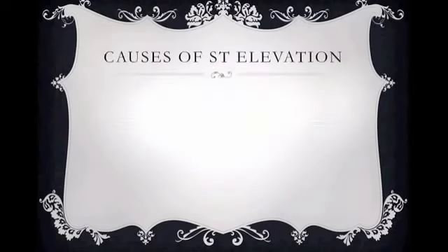ST segment elevation. Well, there's many different causes of ST segment elevation. The best mnemonic that I could find, which I didn't think of, I found it, is ELEVATION itself. And we're going to start with E for electrolytes, and that's when we're mainly talking about our potassium, hyperkalemia. L, left bundle branch block. Early repolarization, our second E. Ventricular hypertrophy. We have A for aneurysm.